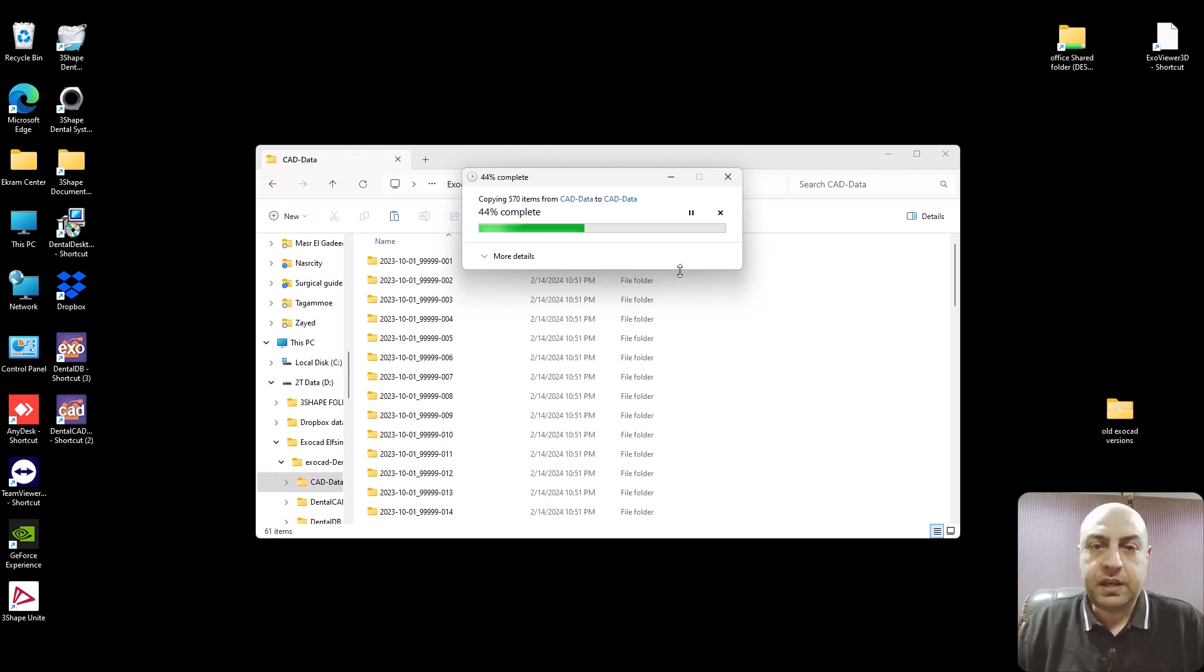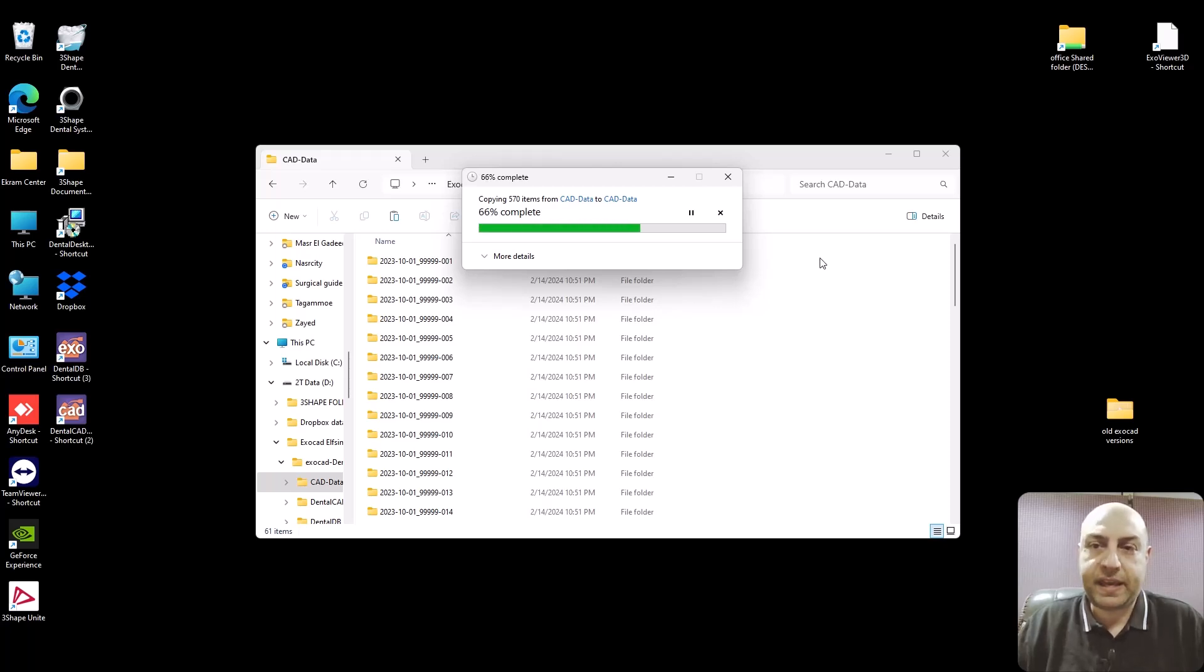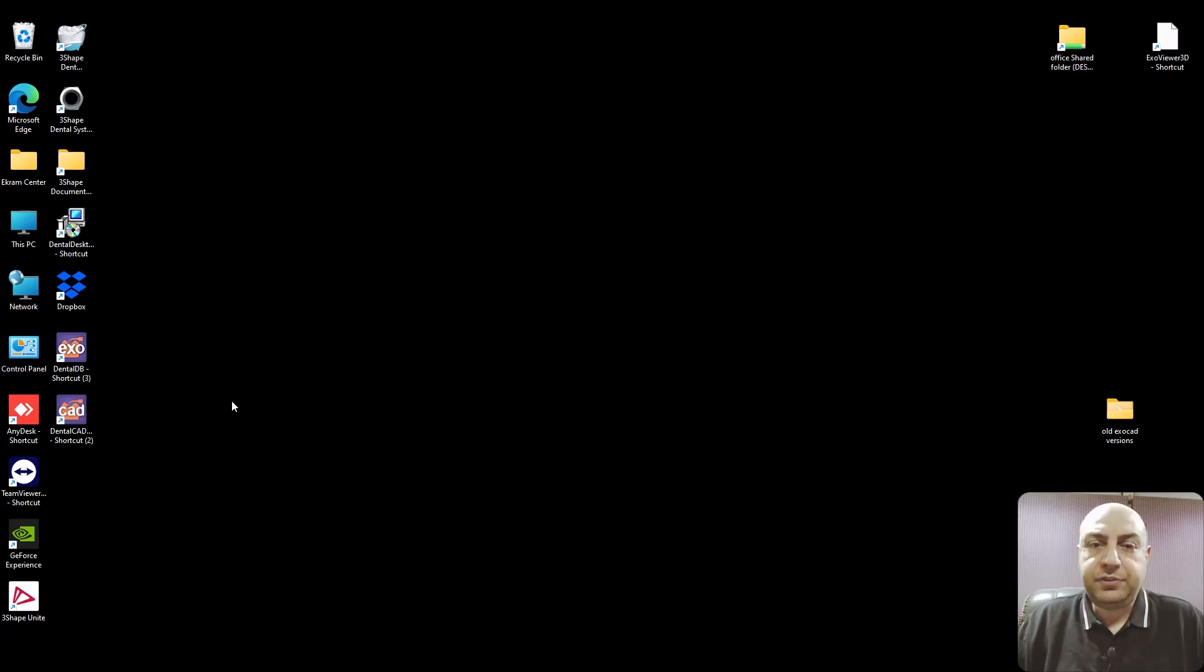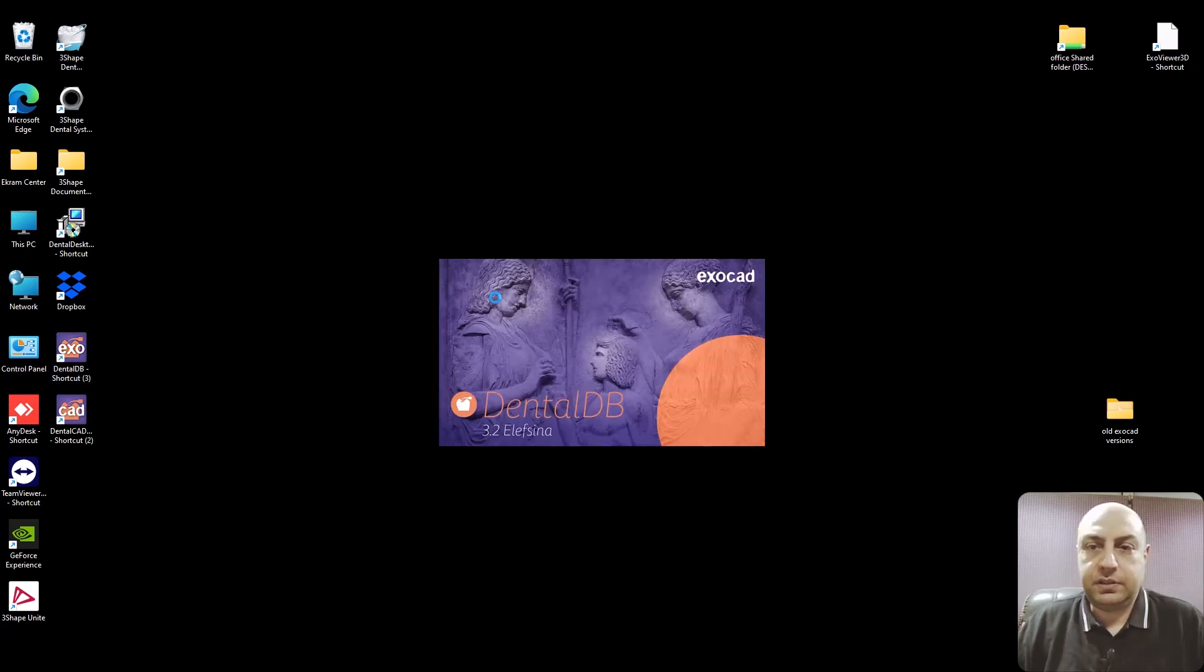Now your project folder will be located in the Exocad, not Exoplan now, it's Exocad platform or software in the database and now after finishing the paste.